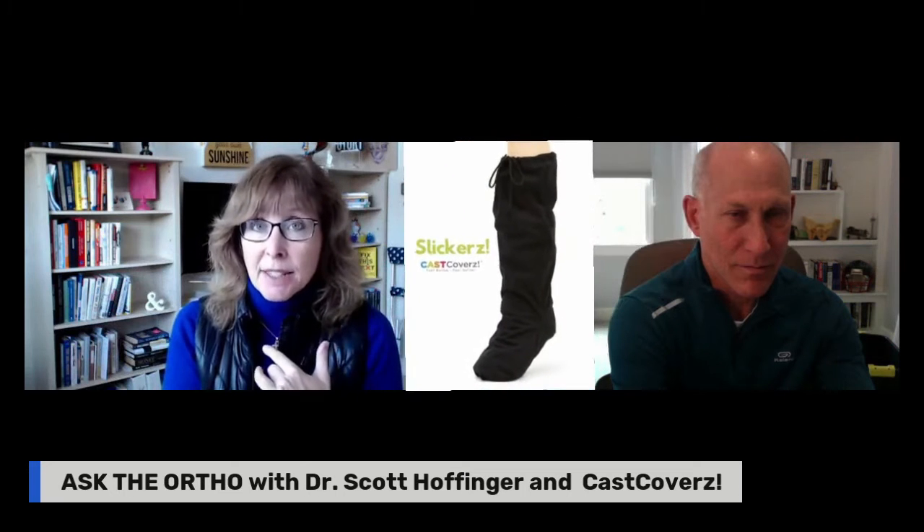For leg casts, we have a similar product called the Slickers. It's the same denier material, so it is weather resistant, and it protects your cast and your toes when you have a leg cast.